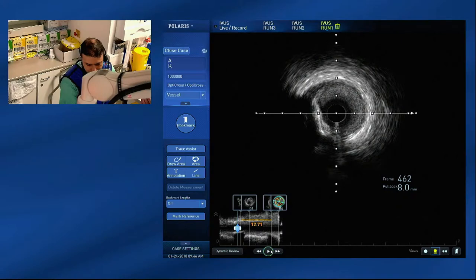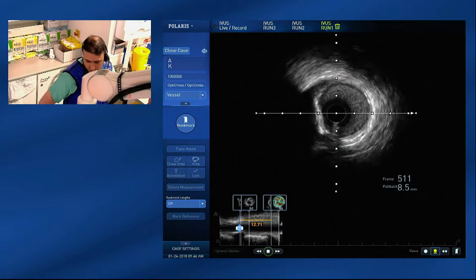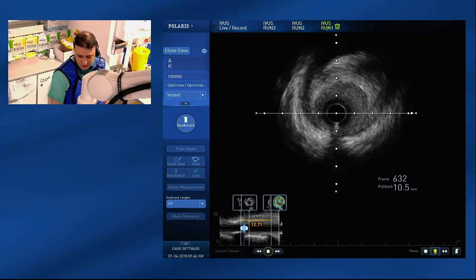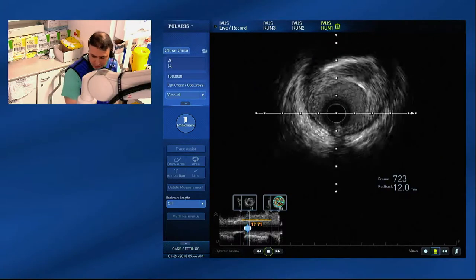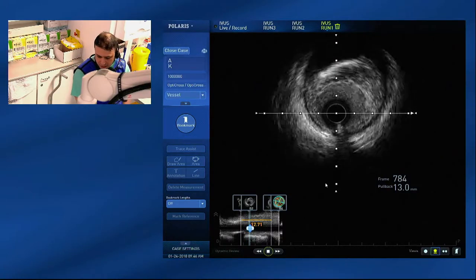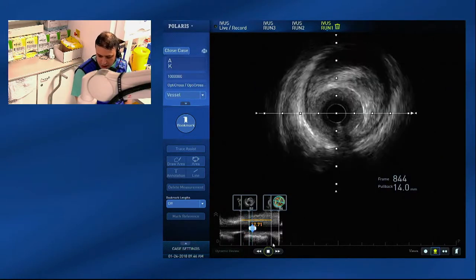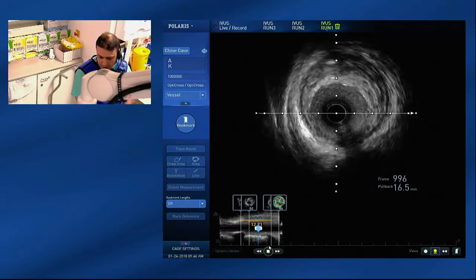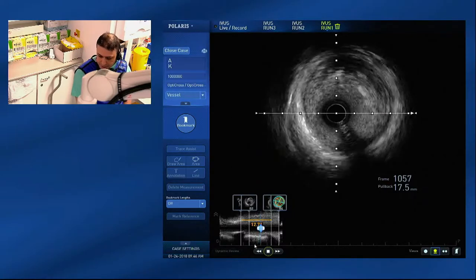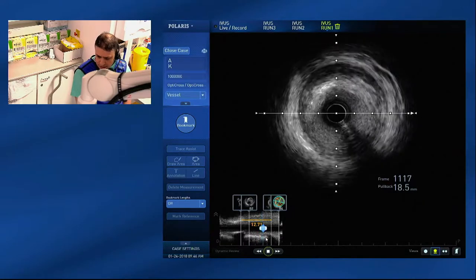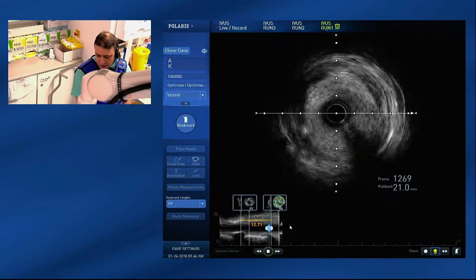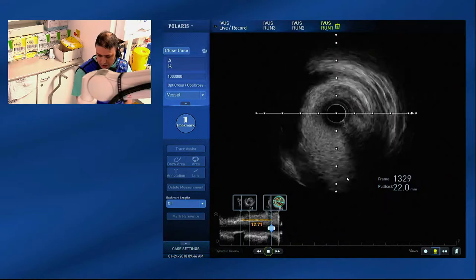This is the IVUS pullback starting from the distal diagonal coming to the left main stem. We've just passed the origin of the LAD and are coming back to the Circumflex. There is a fibrotic plaque which does not cause significant stenosis. This is now the origin of the Circumflex coming at 6 o'clock. We'll show you a bit more of the origin of the LAD.